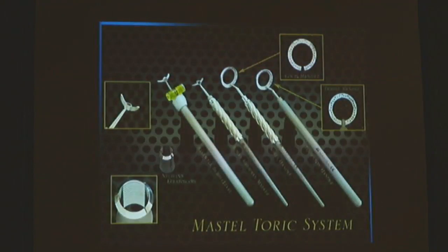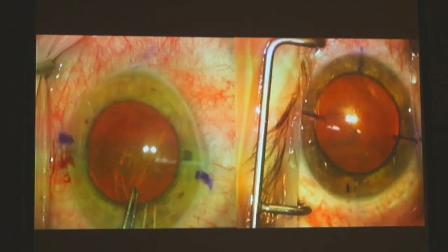And there's, of course, many different markers that are out there, like Mendez rings. You can align up where to put the marks based on your reference marks. Here, for example, we have marks at 6 and 12, or 3, 6, 9, and 12. You can see, by the way, look at patients lying down, and even though we've marked them at 3, 6, 9, and 12, look at the cyclotorsion. This is why we always have to consider, when we mark the patient at least, how they are in the sitting position. When patients lie down, of course, then they typically get some cyclotorsion.